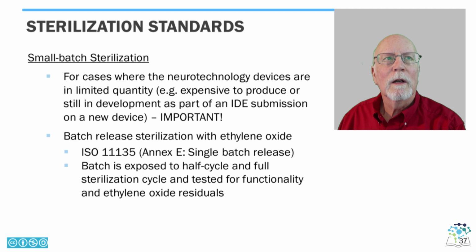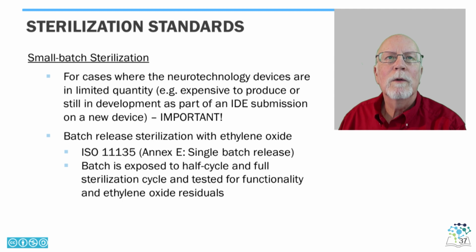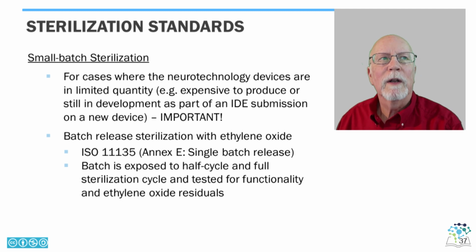Small batch sterilization is another common approach to sterility assessment. It's especially favorable for cases from all therapeutic areas, including neurotechnology devices, which at early stages in development are limited in quantity. That is, the device is too expensive to produce or still in development as part of an IDE submission on a new device.